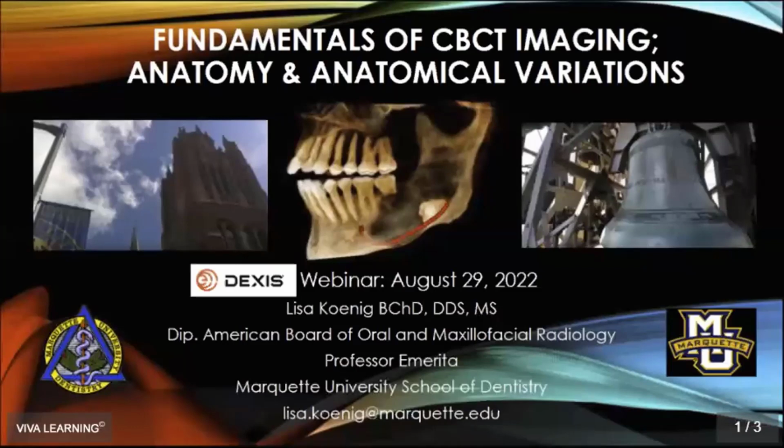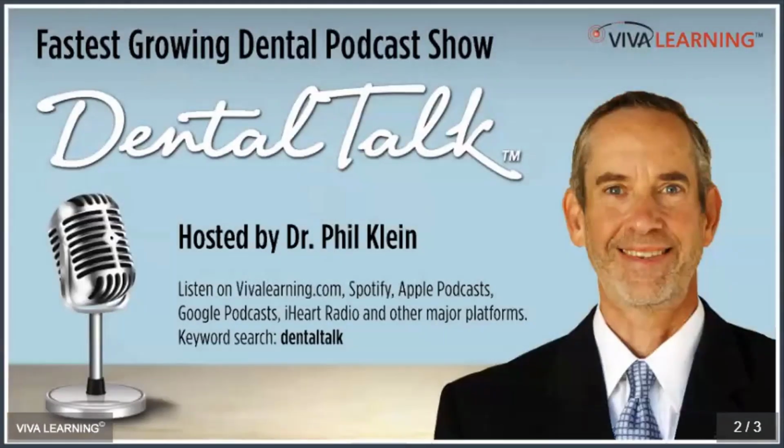I'm not quite sure what this CBCT method of choice since when, what you mean. I think maybe you're referring to this last slide I was talking about. This was an article that was put out in 2012. And at that time, there were some machines out there on the market that were doing volumetric imaging.